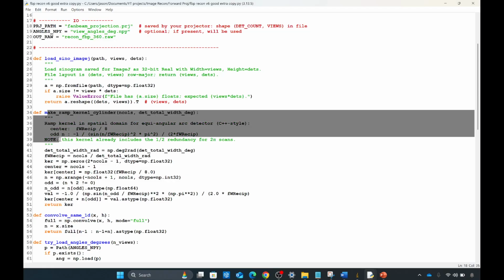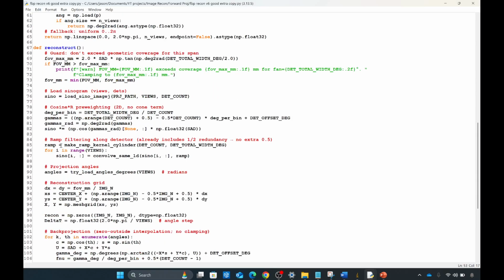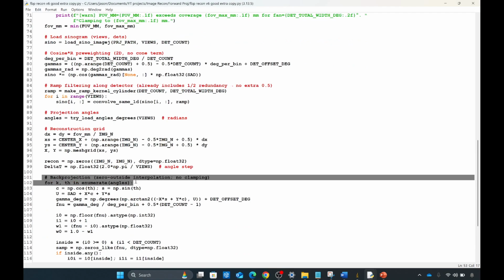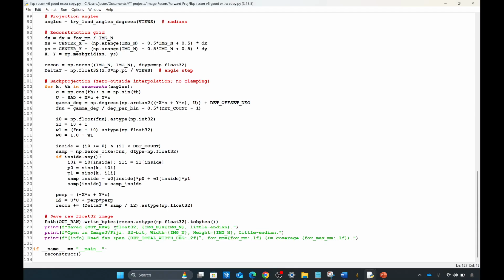In the frequency domain, we use multiplication. And here in the image domain, we use convolution. Then we reconstruct the image, backprojecting the filtered projection data. And here is the loop over all the detector elements, the angles, and the detector index. Finally, we save our image to a raw file, and we will use ImageJ to visualize it. So now let's run it.